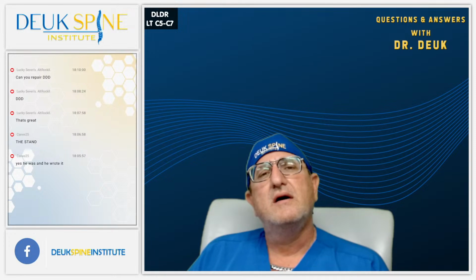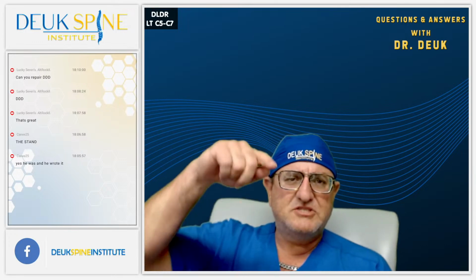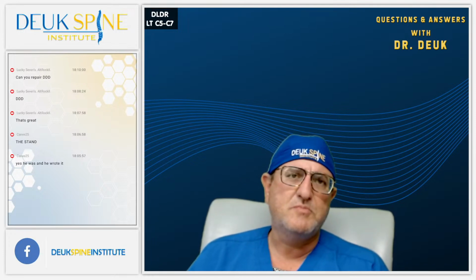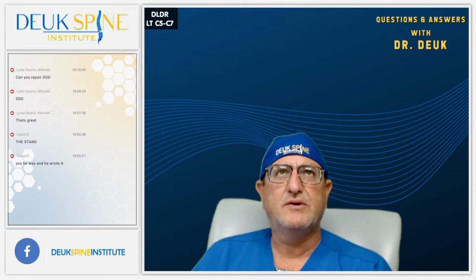And that was quite a story on that patient, but we're going to cut it short because it's been a long day here. So we just finished this lady, and we did everything we needed to do. I inspected the back of her herniation from side to side, foramen to foramen, and everything looked fantastic. We took out probably 30 pieces of herniation in the end there, some big, some small. You guys got to see a big one, right? And it was stained blue, because that's what happens when you get a herniation over time.